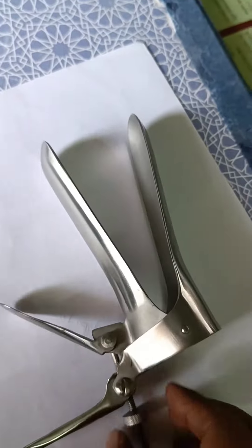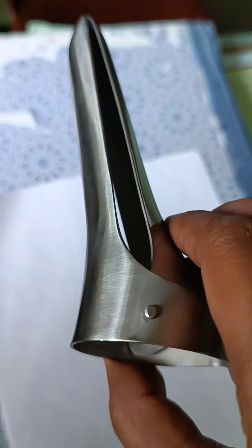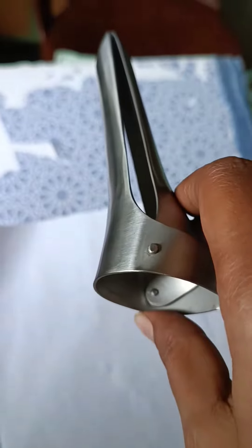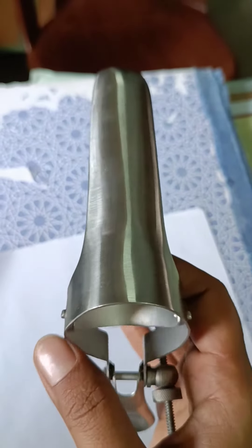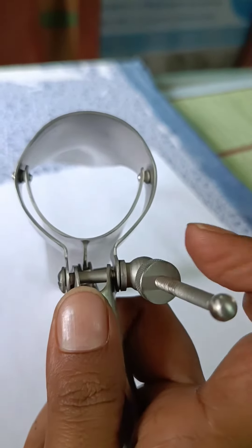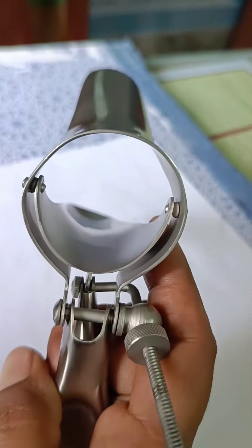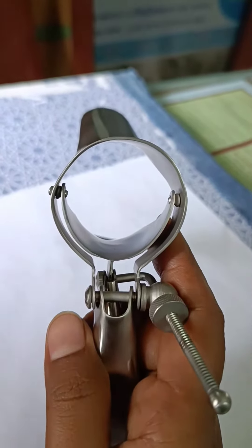When introducing the bivalved Cusco speculum, insert it in a closed manner. The direction of the Cusco speculum should be to one side as you introduce it into the introitus. After that, your hand direction should be downwards. Then open it to properly visualize the cervix, and fix the screw so it is self-retaining.